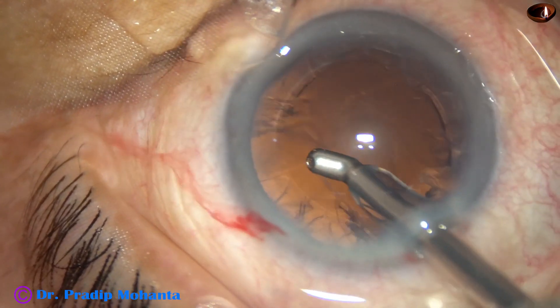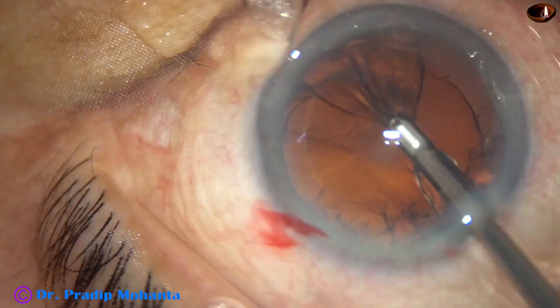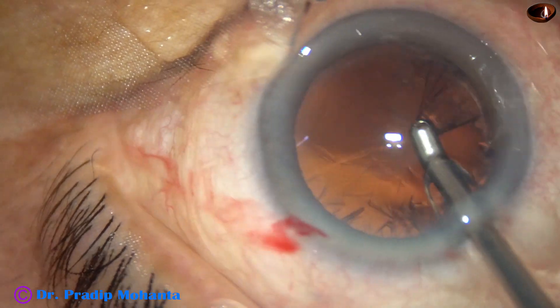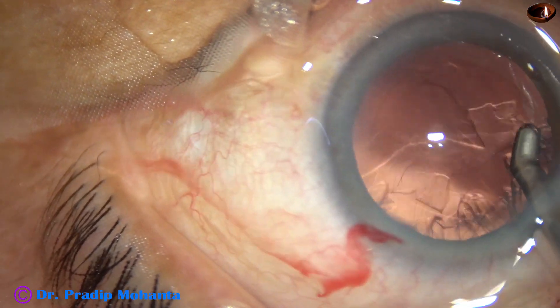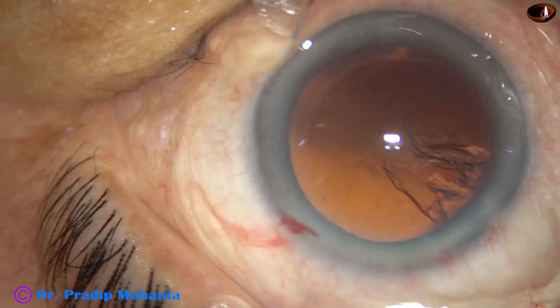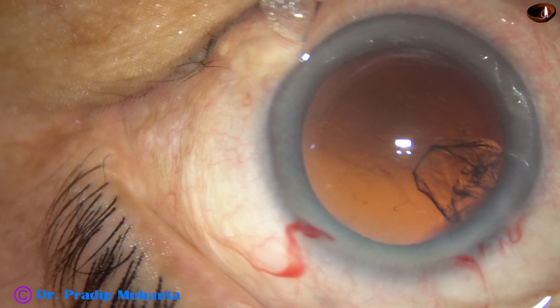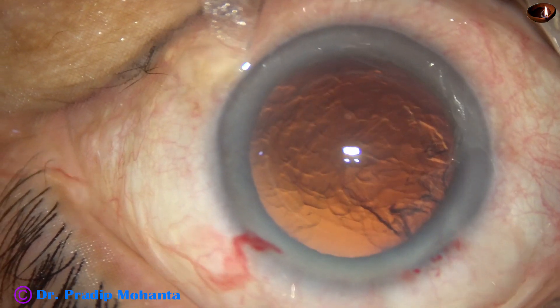At this time the vacuum is 300 and flow rate is 30. Most of the cortex was removed by the coaxial IA. The sub-incisional cortex was not removed — I plan to remove it by the Simco cannula.